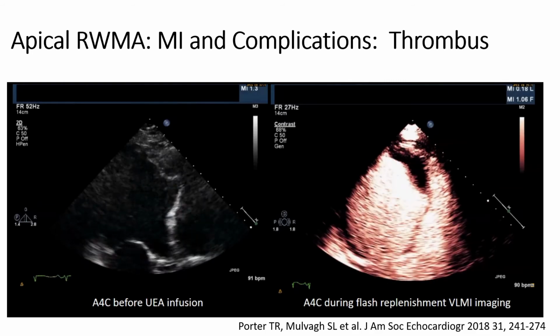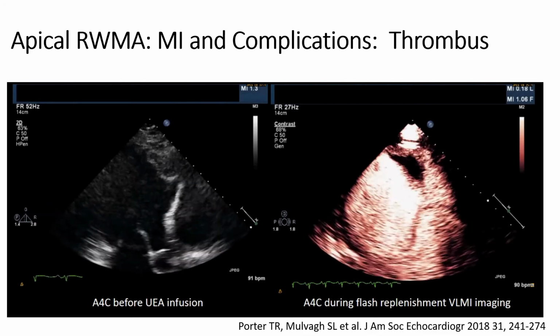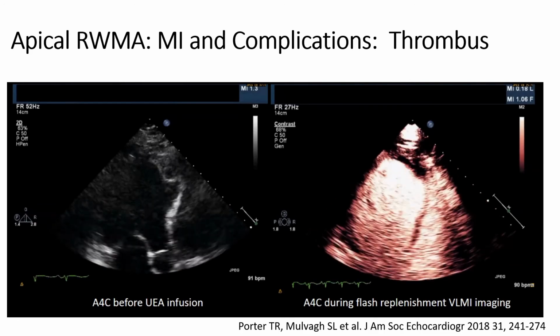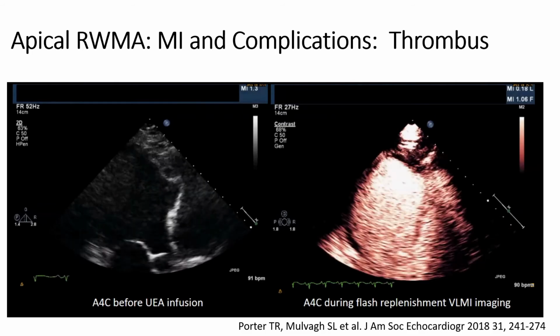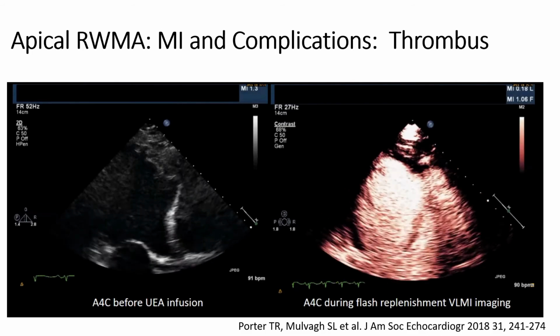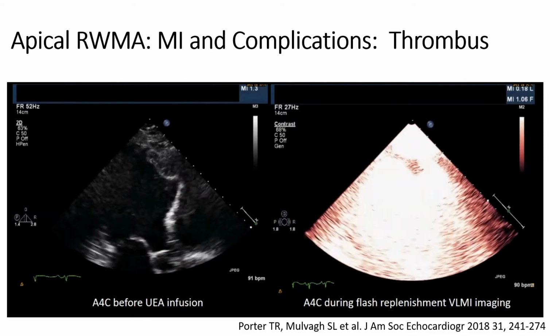Complications of acute cardiac ischemia are often seen in the critical care setting. Here is a patient with an obvious apical wall motion abnormality and findings certainly consistent with an apical thrombus. However, with contrast enhancement, the extent of the thrombus and actually the mobility along the edge of it can be readily seen, and the infarcted area is more clearly identified.